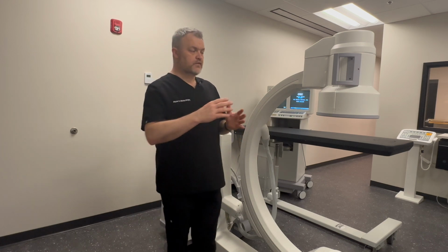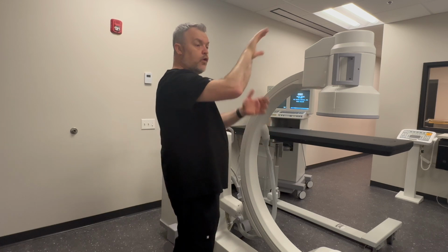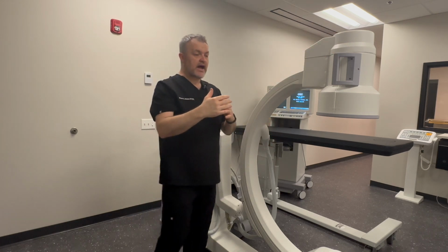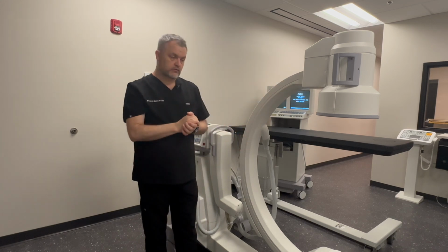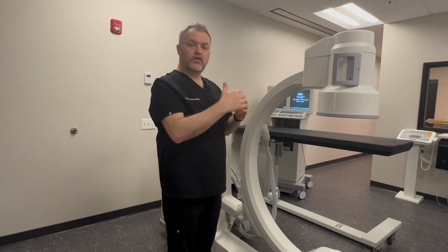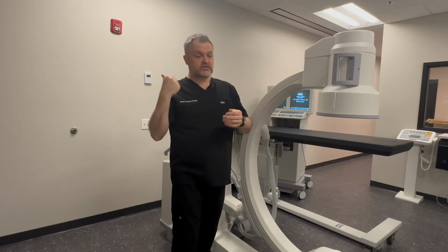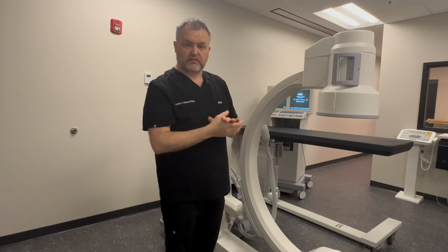This other feature is what we call roll. This is where we can take the intensifier and roll it over the patient or roll back. So if we're in for a spine and we're looking to demonstrate an oblique, then we can use this feature of roll. Again, I don't call this feature oblique because depending on my approach to the patient, it may not be an actual oblique. If I'm coming in above the patient for a clavicle and I roll over, I'm now shooting an axial for the clavicle.